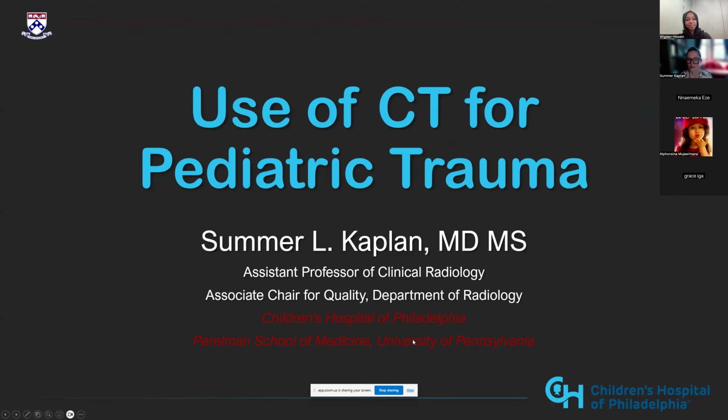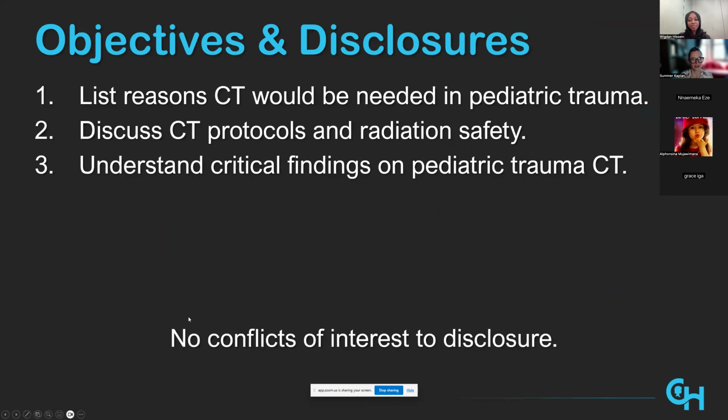Welcome to use of CT for pediatric trauma. I'm looking forward to discussing some cases with you. And as was mentioned, we'll be talking about reasons why you would want to use CT in trauma cases. We'll talk a little bit about CT protocols and radiation safety. And then we'll also go through some cases and talk about critical findings on pediatric trauma CTs.